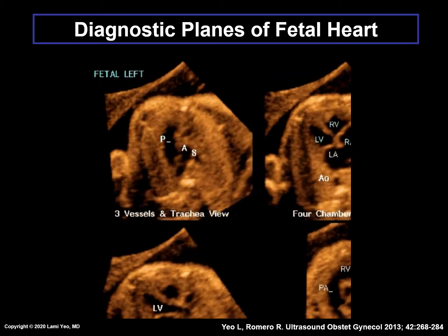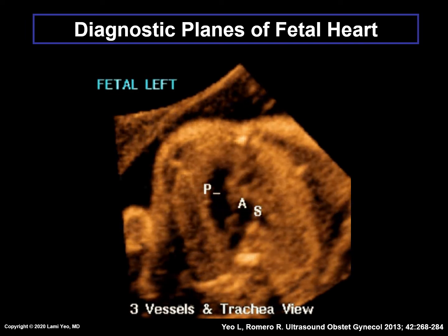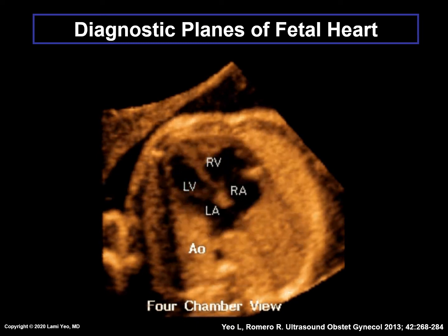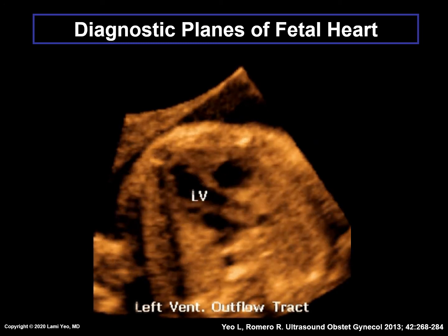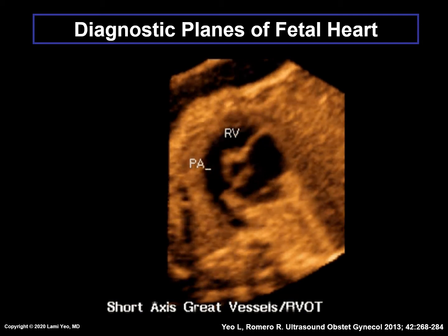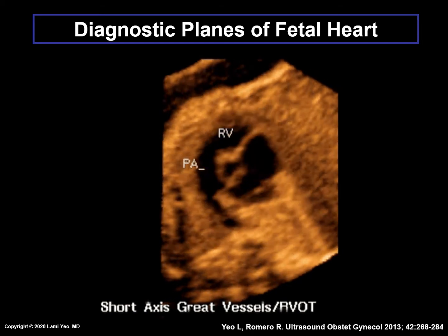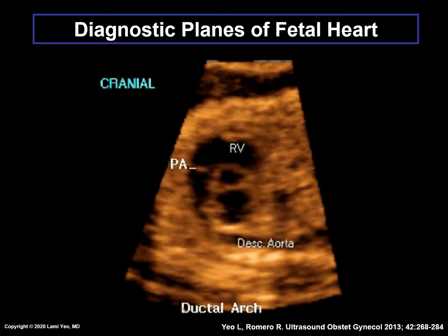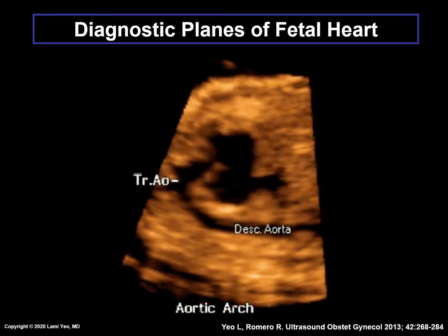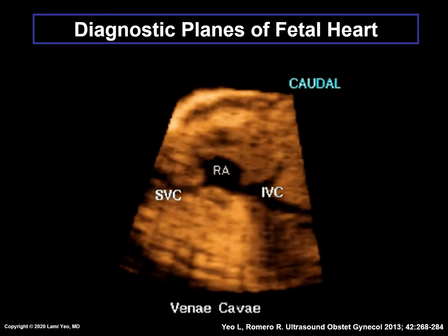For ease of viewing in this presentation, each of the nine diagnostic planes is shown magnified in sequential order: the three vessels and trachea view, four-chamber view, the five-chamber view, left ventricular outflow tract, short axis view of the great vessels, right ventricular outflow tract, abdomen, ductal arch, aortic arch, and the superior and inferior vena cava.